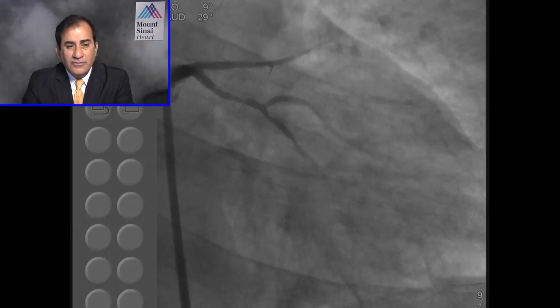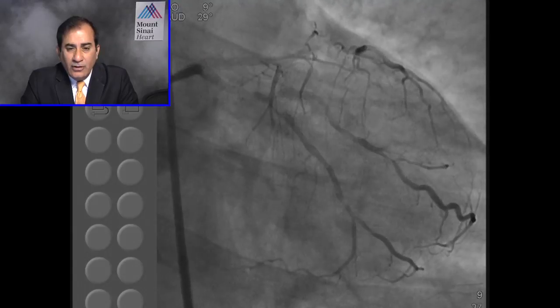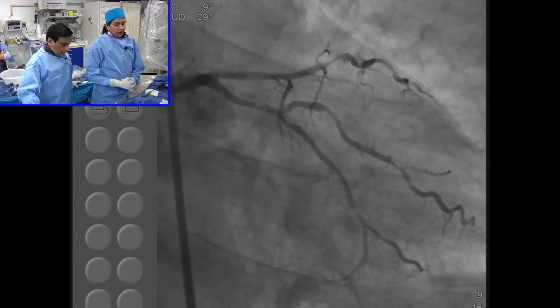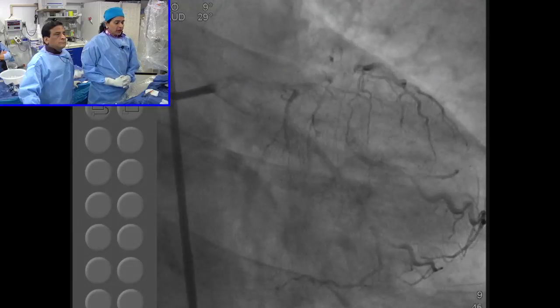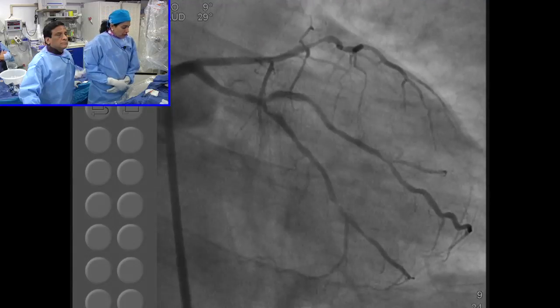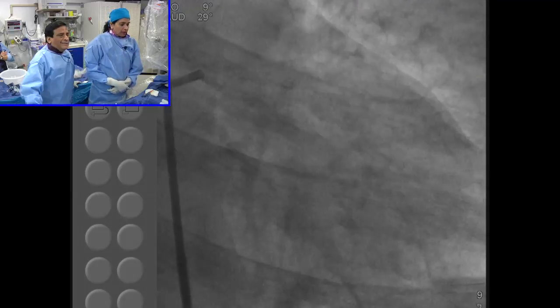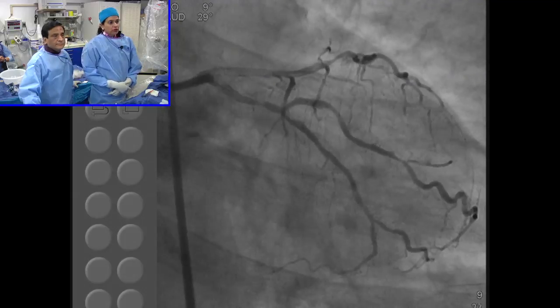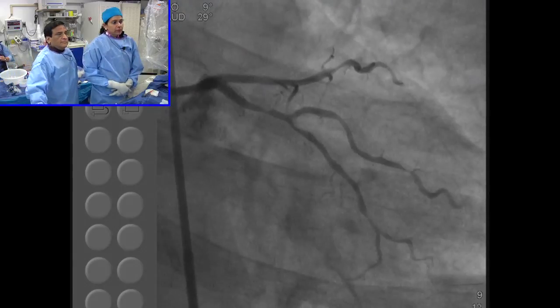Yeah. That was the first question which had come specifically for you. Is this a 7 French, and do you almost always recommend a 7 French? If you are thinking of double stent, which I always teach our fellows, once you have a bifurcation and you know there is no access problem, I mean our case is femoral and we know there is no groin issues, I always tell them go with 7 French. Now if there is an access problem and you can only do with 6 French, can we do it? I think 2.5 stents can go through a 6 French, but when we are going 3.0 and 3.5, 2 stents through a 6 French becomes problematic.